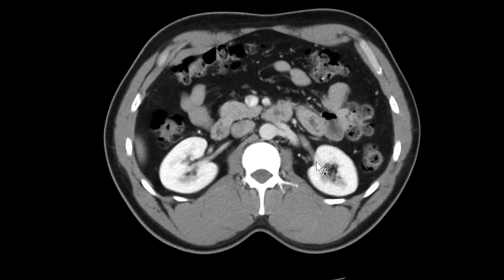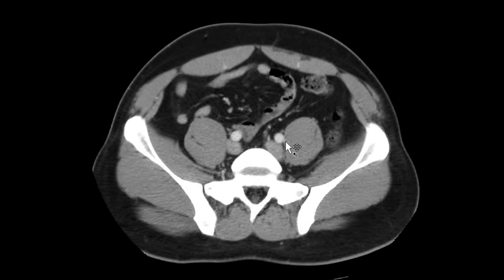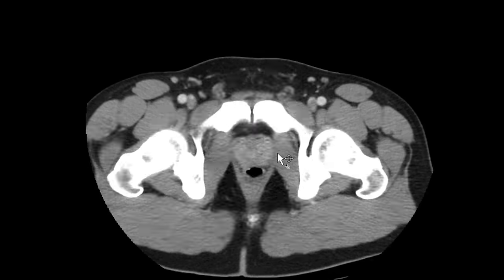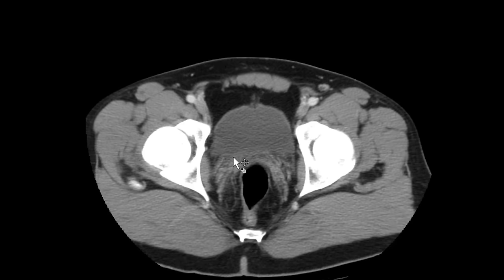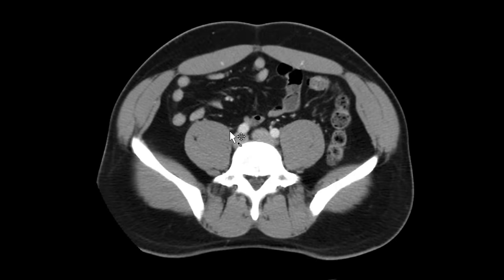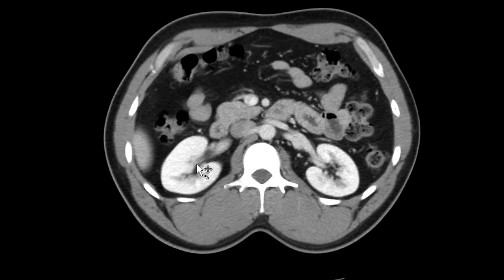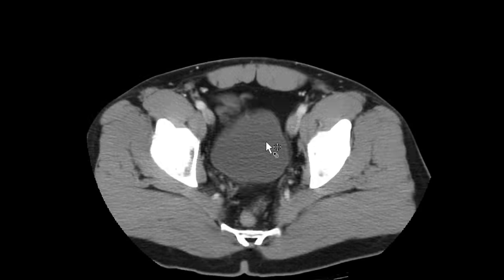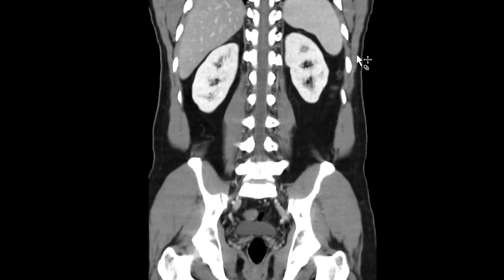Then I follow the ureters down. This isn't ideal for looking for stones in the ureter because it is a contrasted study, but you can catch a big stone if you see one. I follow the right ureter up, and then I go back down and look at the bladder to make sure there's no bladder wall thickening or stone floating around in there.